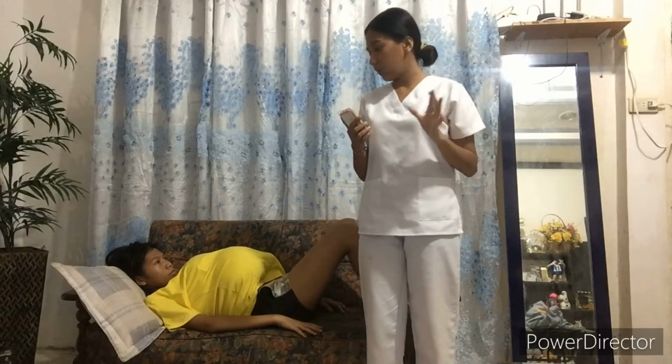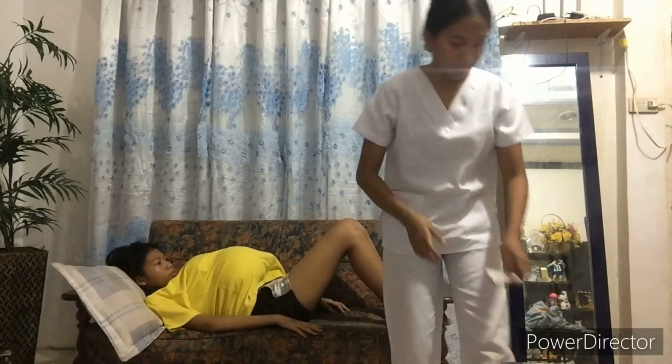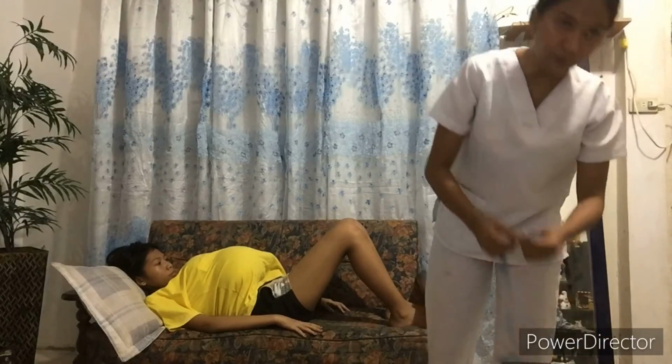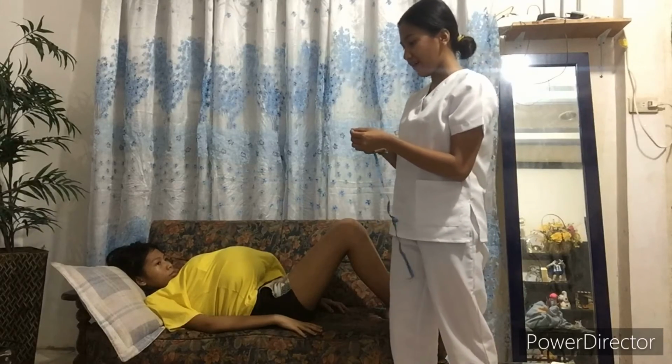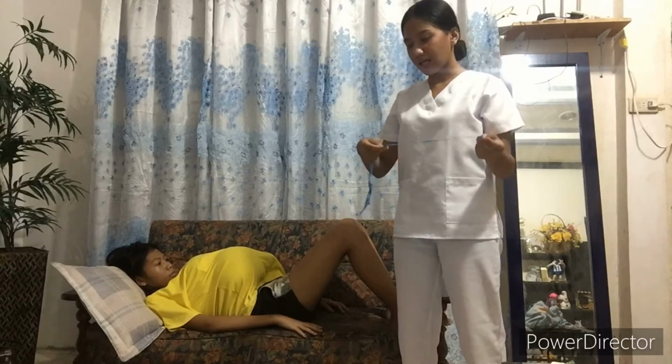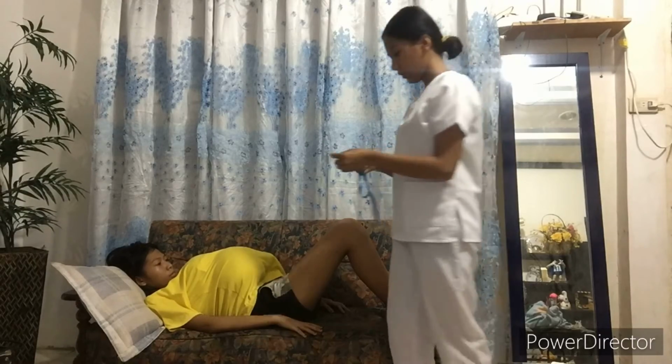After that, we will measure the fundic height using a tape measure starting from 0 centimeter. So, the centimeter side should be facing the abdomen and the inch side should be facing the examiner.